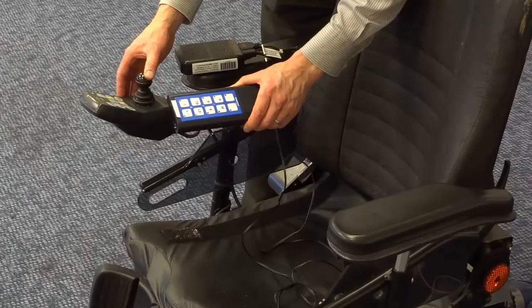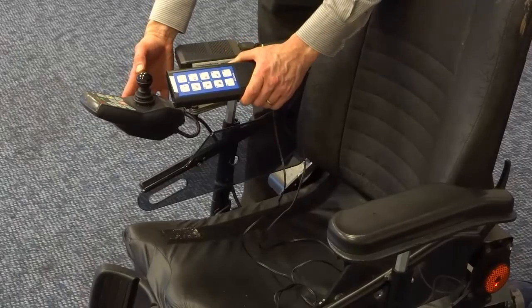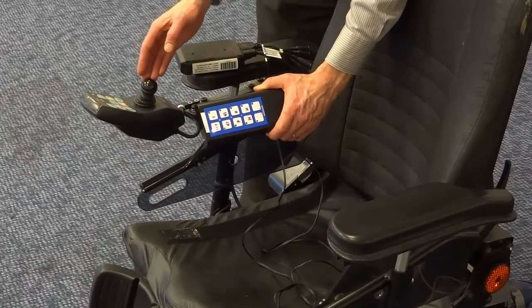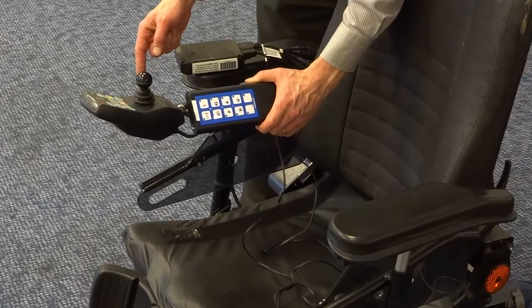This is the Housemate Light set up with a single switch scan. A joystick deflection will now control the scan on the environmental control unit, selecting channels and operating the device.